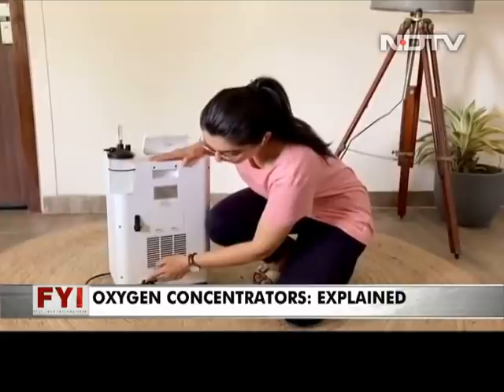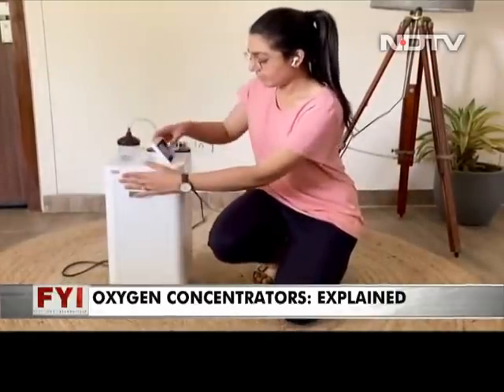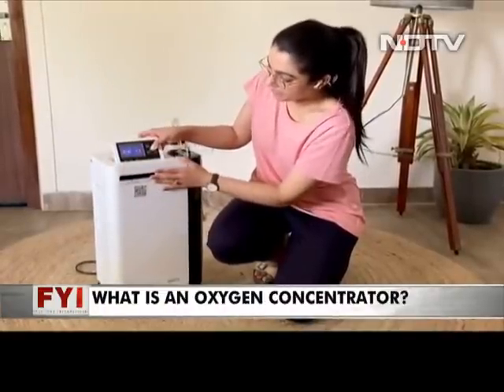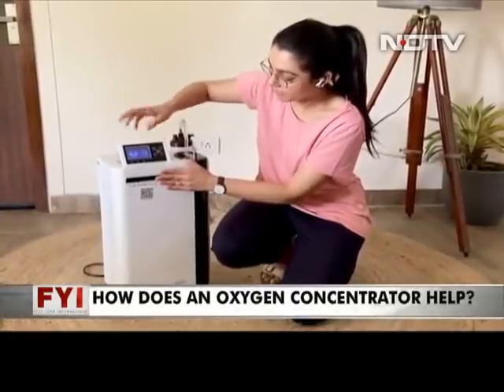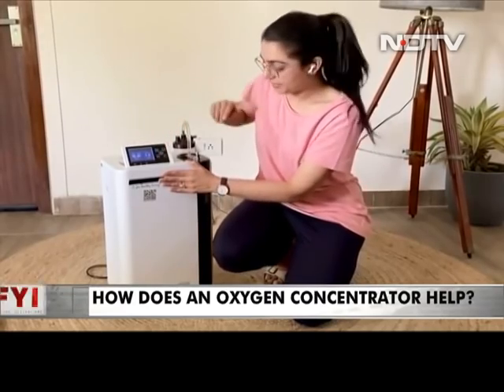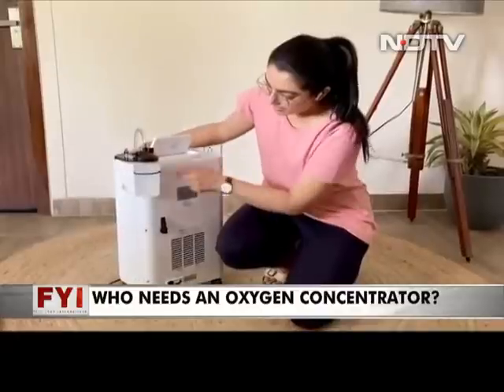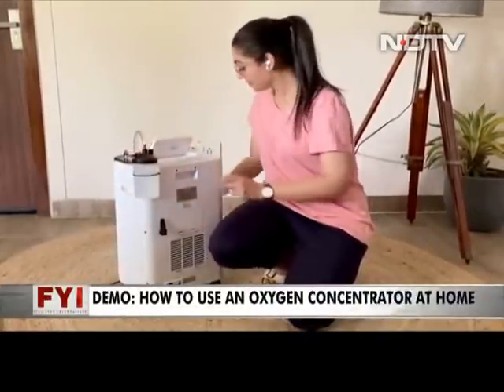So let's put it on now. Power button on. On the LCD over here, press it in. It's showing me the flow, it's showing me time if I want to fix one. Let's try it on maximum capacity. So 5 liters a minute. Now the minute I put this on, you see the bubbling over here has begun. That means it's now functioning.